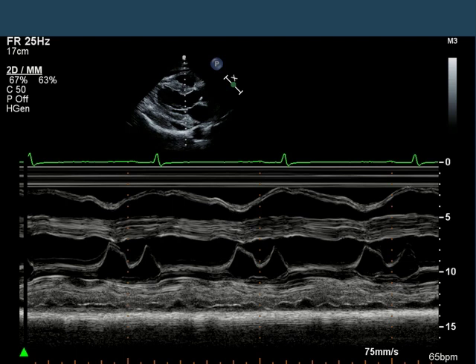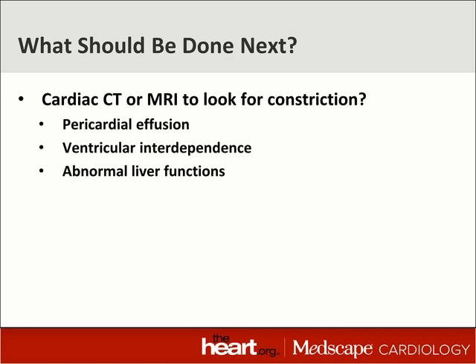So, what do we do? He's on a statin — that's all he's taking. His CKs are off the wall. His transaminases are high. He has evidence of pericardial tamponade physiology with a moderate circumferential pericardial effusion. You can probably guess that effusion didn't get there overnight from its size, because considering its size, these tamponade findings are not the worst case we've ever seen on an echocardiogram. Do we stop the statin? Do we do a pericardiocentesis? Do we do both? Do we do neither? Should we look at an imaging study to look at constriction? Is this constrictive pericarditis? Maybe the statin has nothing to do with it. After all, he has a pericardial effusion — maybe that's part of some inflammatory process involving the pericardium. There is ventricular interdependence, seen clearly on the pulse wave Doppler of the mitral valve as well as the 2D and M-mode imaging, and his liver functions are abnormal. That's how constriction presents. But there's only one problem: did you notice that despite the tamponade physiology, his heart rate's only about 60 beats per minute? He's not taking a beta blocker — he's just taking a statin.